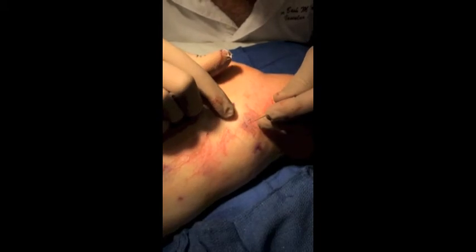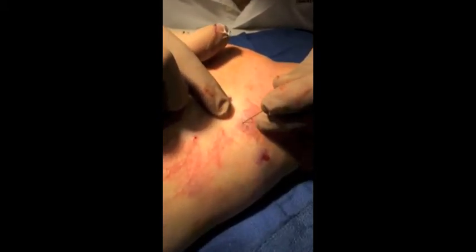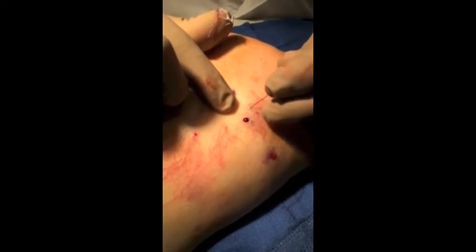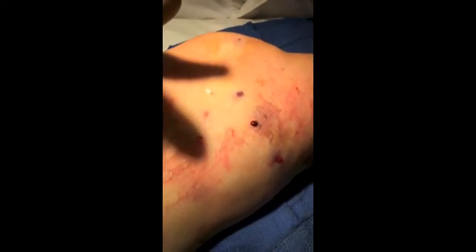You can see there's just a little bit of thrombus formation here, so we just relieve that — give it a little chance to get out of there so it won't stain.